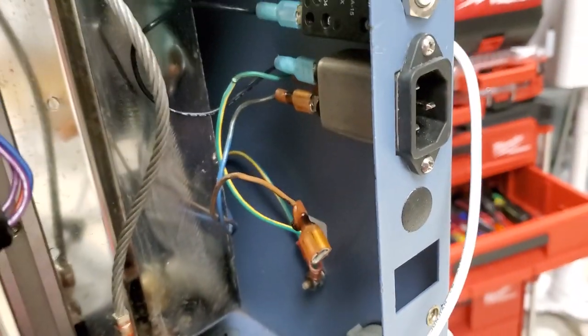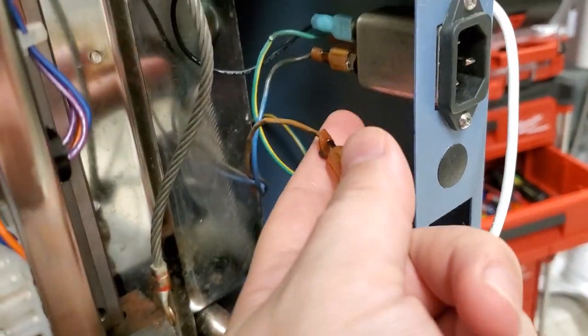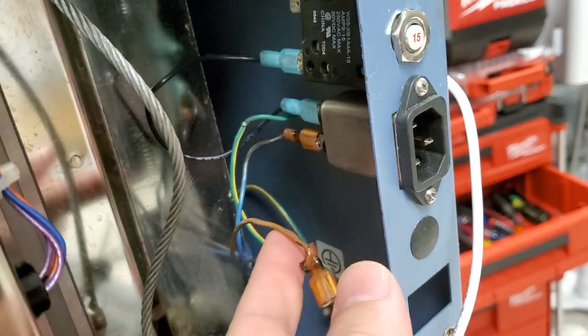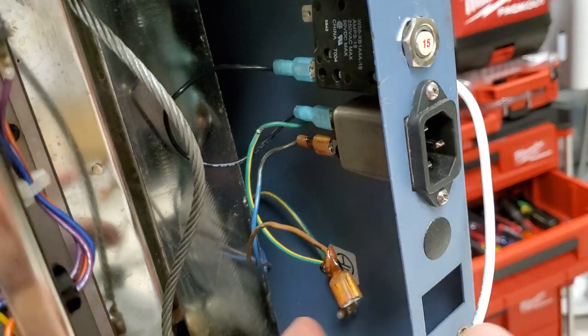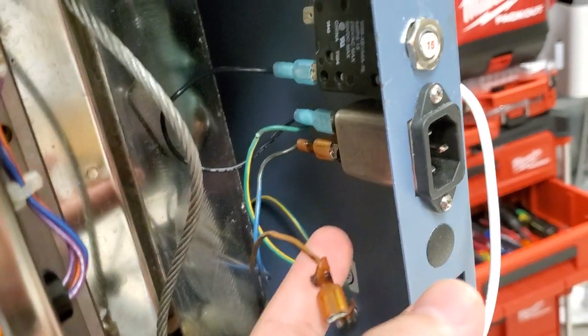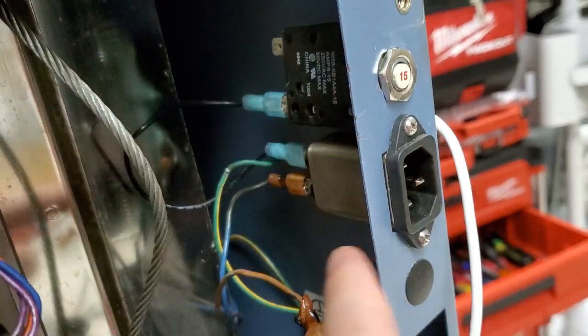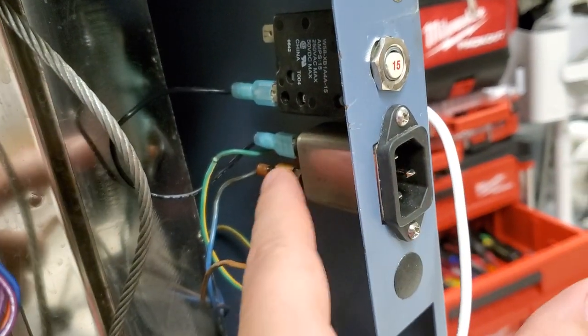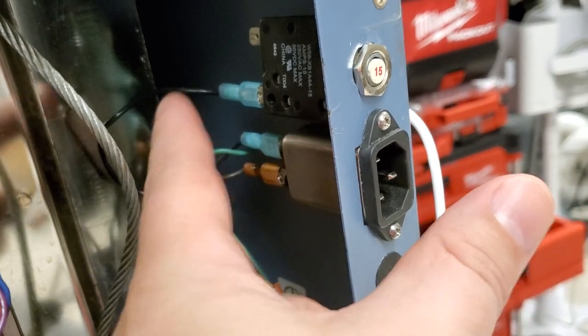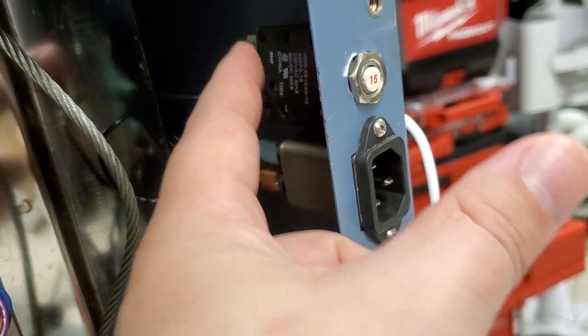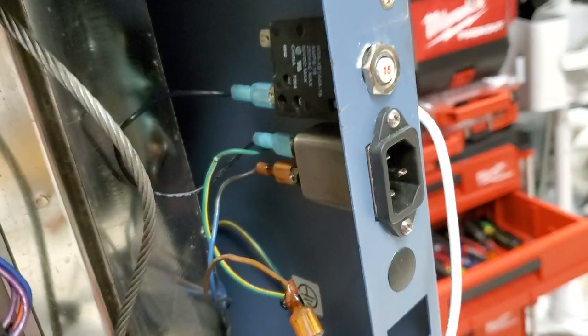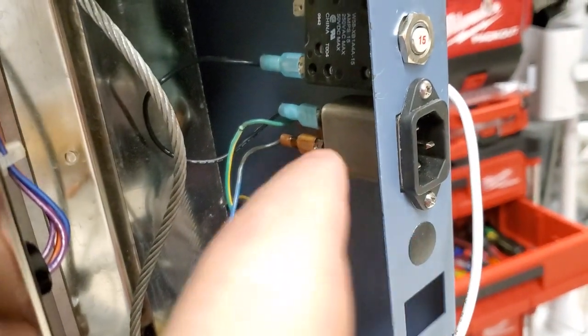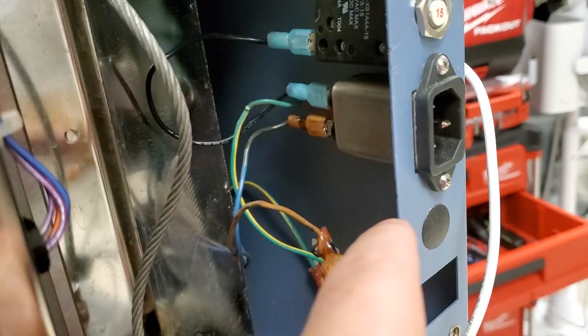So here you can see I've already removed this one. This would be my breaker switched hot. It normally connects to the top of the breaker. Here you can see the hot comes in from the IEC, comes up to my breaker and that goes back to control panel and the heating element and stuff like that.